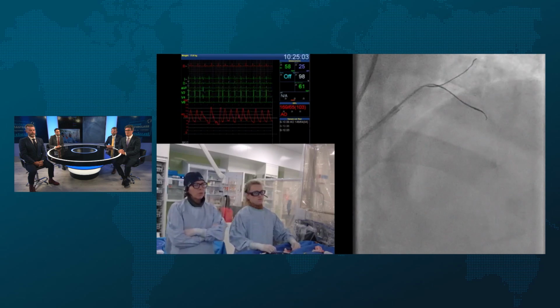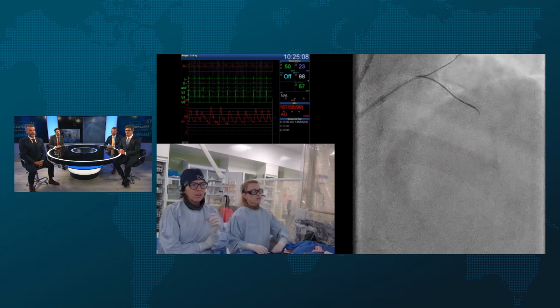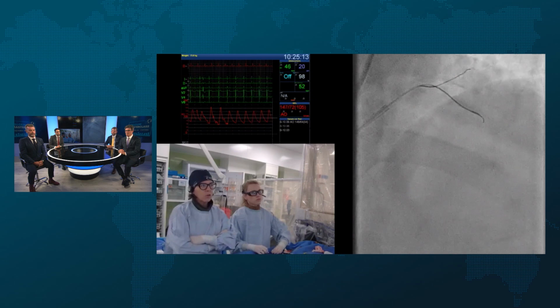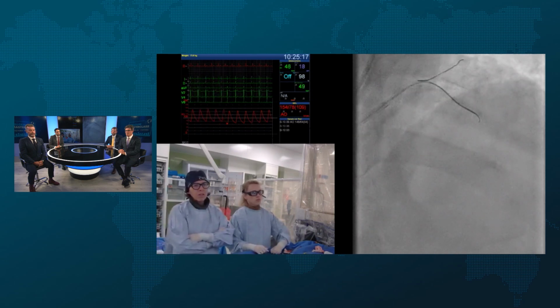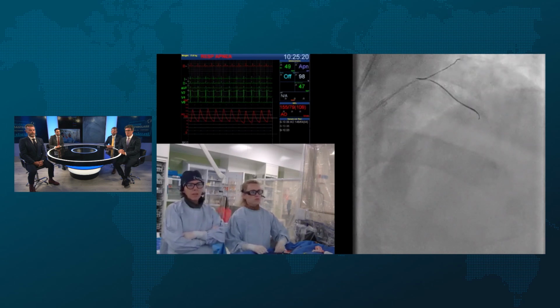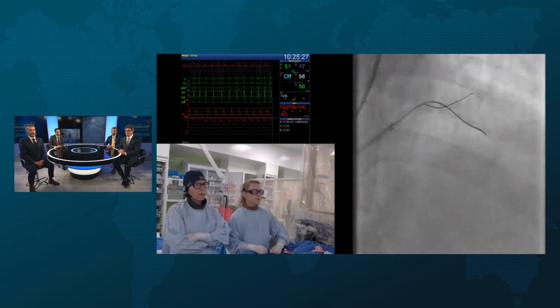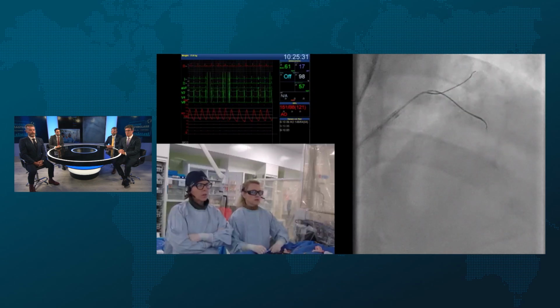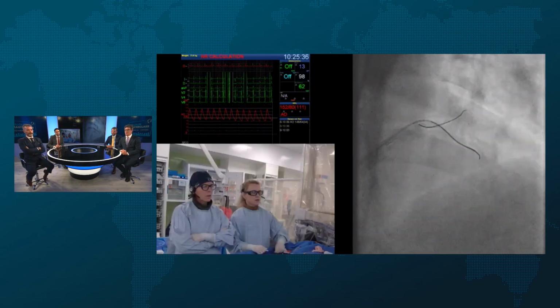Yeah. So hopefully we'll get down, and then you see that beyond that point there's actually a focal area where it looks like maybe angiographically it's suspicious of a small nodule, and it's also very tight there. So I think the microcatheter is a good idea just to support crossing that segment as well. Yeah. So Claudia, do you think you've exited yet? Yeah, so I think I've gone past that first post-aneurysmal lesion, and now we're at the... Looks like the wire position looks a bit funny though there. Might be subintimal here. Yeah, I'm not sure I like that very much.